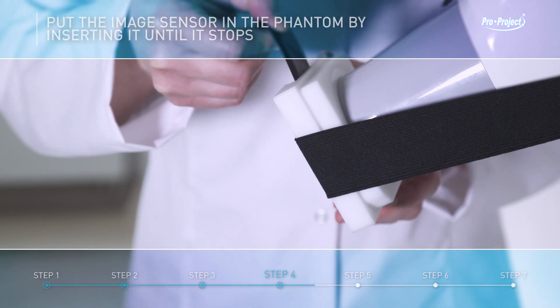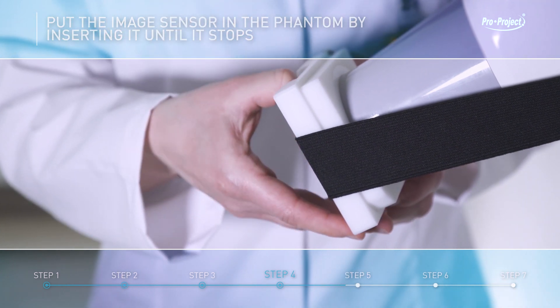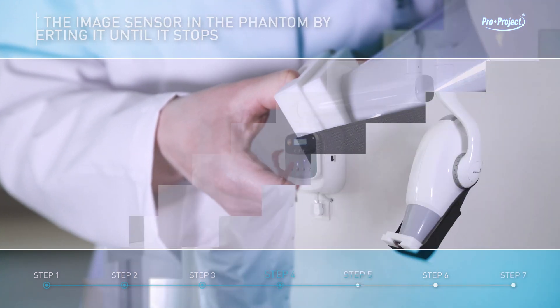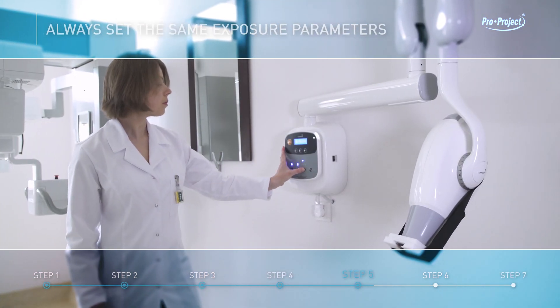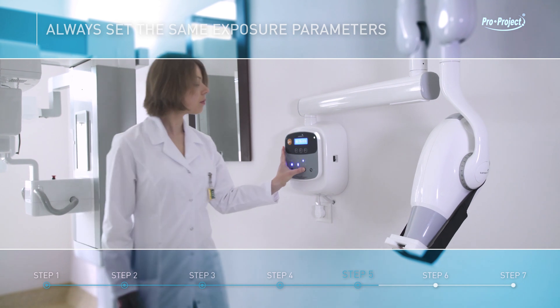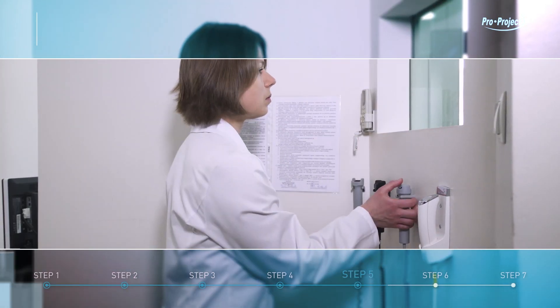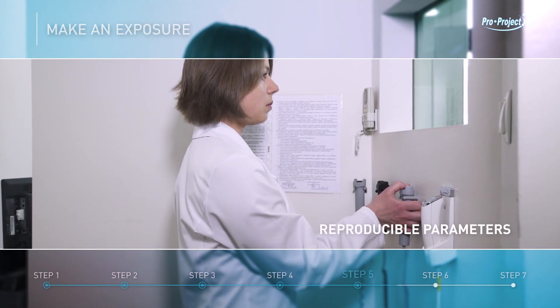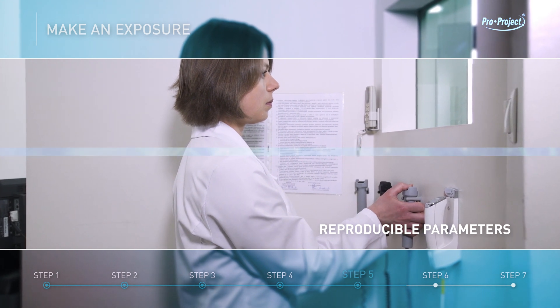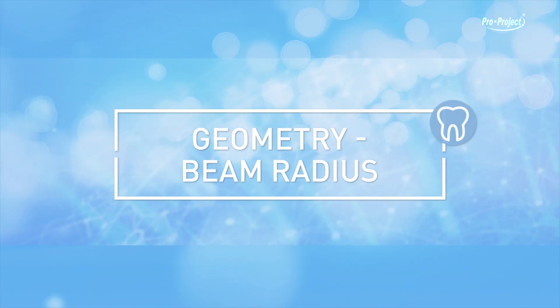Put the image sensor in the phantom by inserting it until it stops. Always set the same exposure parameters. Make an exposure. Geometry, beam radius.